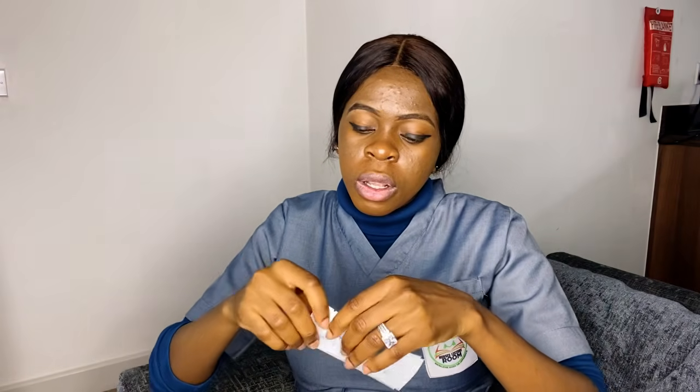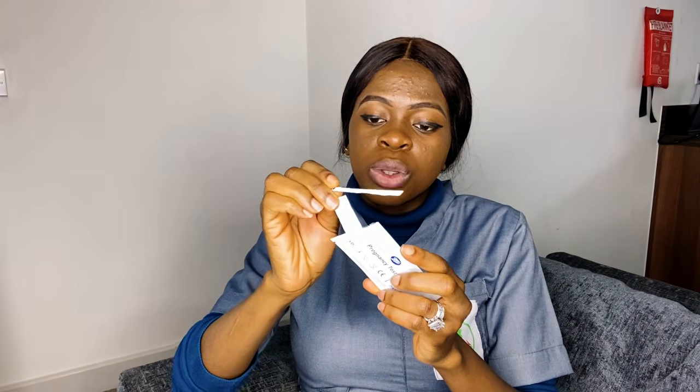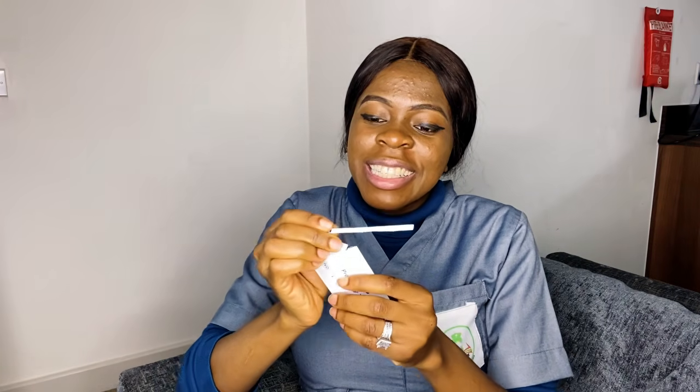All right. So the first thing is, most pregnancy test strips usually have steps on how to go about it. So I'll just open. This is one. I've opened it, so I'll take it out. You normally discard this. These are more or less preservatives, so you don't need this for anything. So don't think, oh, what should I use this one for? It's inside the pregnancy test. This is what you need.